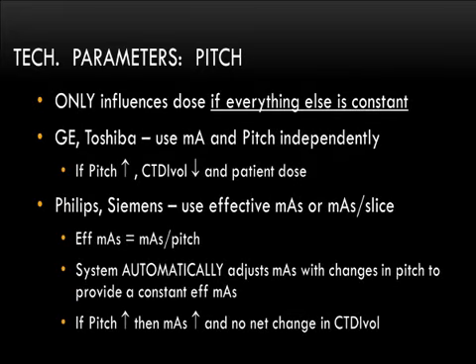Now, here's the thing that I really want you to remember. Pitch only influences dose if everything else is held constant. If all you do is change the pitch, but everything else is kept the same, then dose will be affected by pitch. Sometimes these things happen outside of your view, and it's not clear from the user interface.